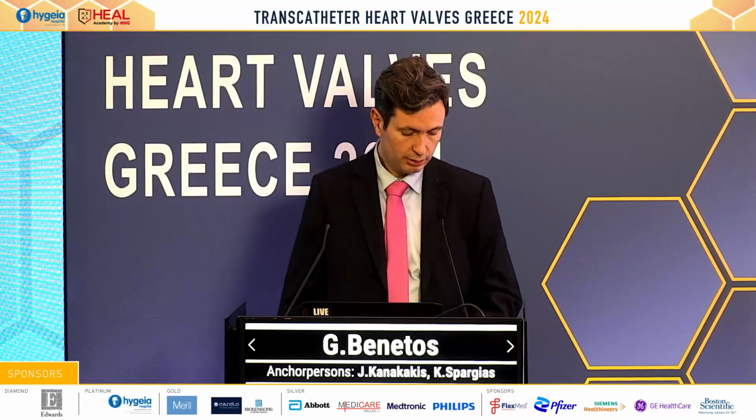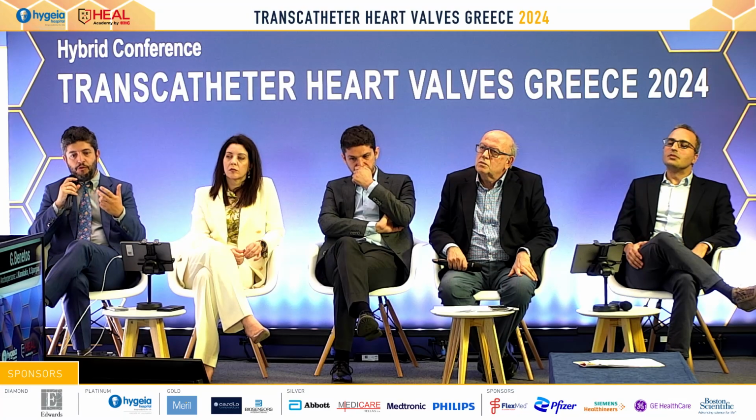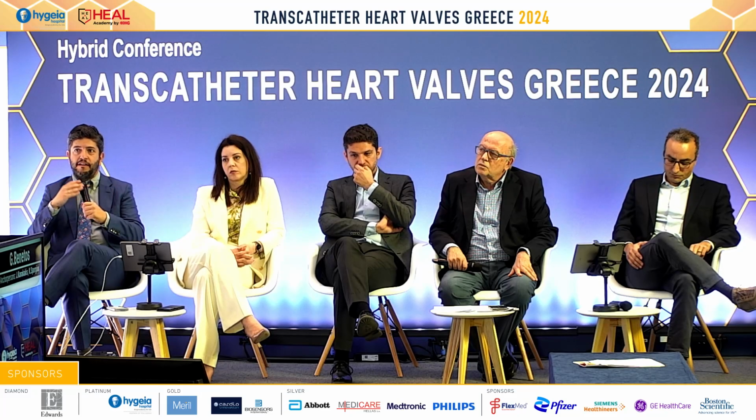Sorry, but I mean also the opposite. If the echocardiography is not sure if the aortic stenosis is severe, let's say in patients with paradoxically low flow, low gradient AS, or other compelling echocardiographic studies, can we base our decision on the CT scan? In extreme cases, for example, calcium score more than 3,000, then I'm sure that's severe stenosis. In other cases the calcium score is 100, so I'm sure that it's not a severe stenosis.